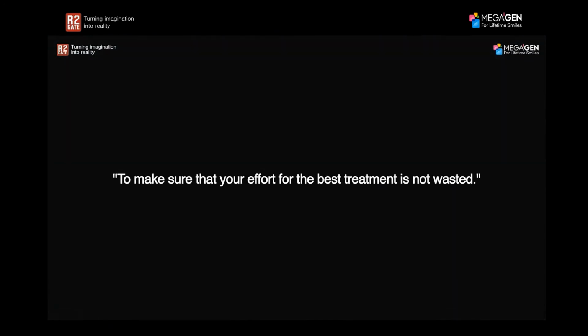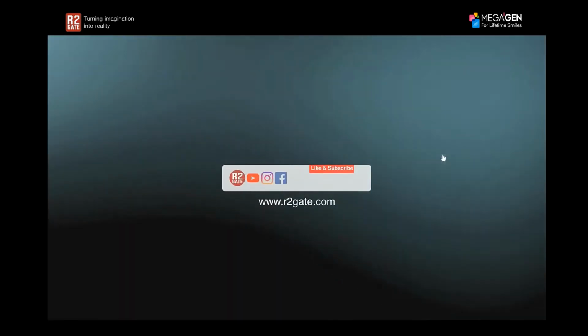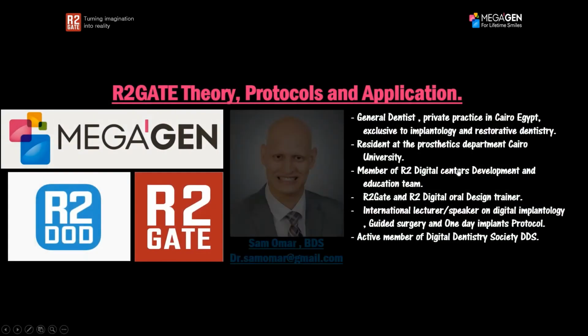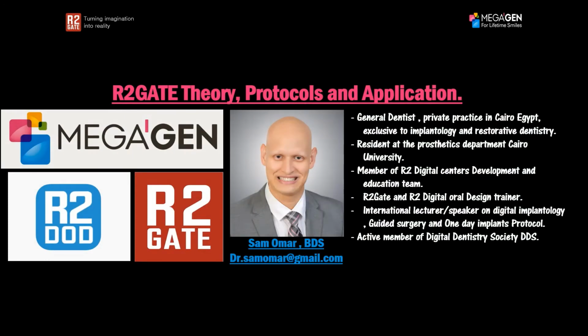But now I really need to focus with this video on certain things, and I'll focus more today on using R2GATE as a treatment planning software for implants mainly. So let's just go ahead and focus on that today. And the reason why I would like to focus on this topic is because I think there's really a lot of information that people might need to receive in order for them to utilize this software to the fullest. Today, again, my topic is R2GATE theory, protocols, and application.